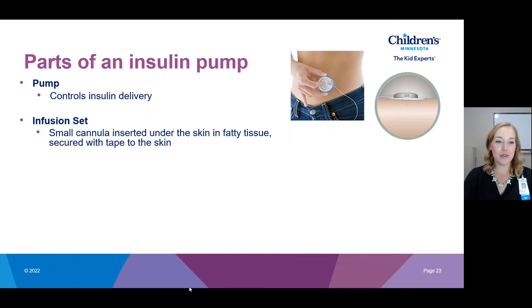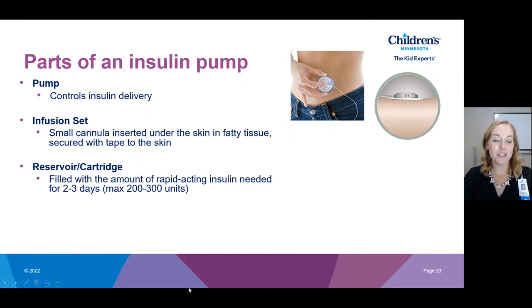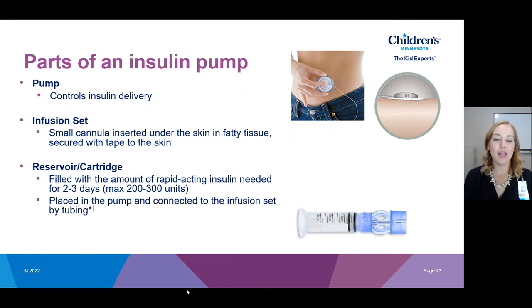The third part of the pump is your reservoir or cartridge — this is the piece that holds all the insulin to be delivered. We fill our cartridges with enough insulin to last two to three days, and the max fill is 200 to 300 units depending on which brand of pump you're using. The reservoir is then inserted into the pump and connected to the infusion set with tubing, all coming together as one connected device.